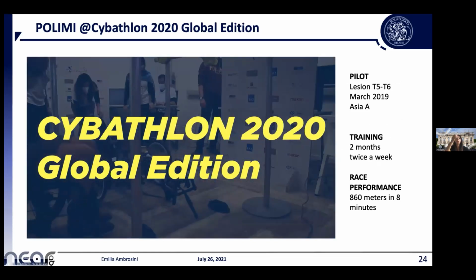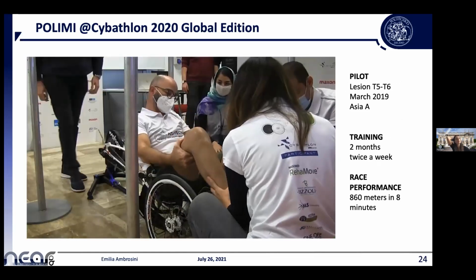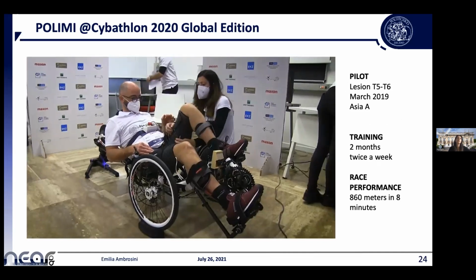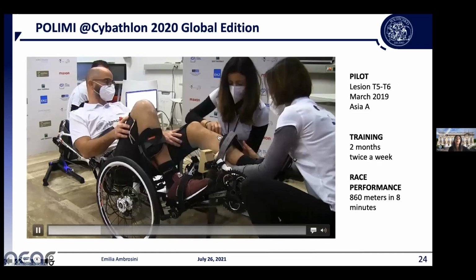As I told you, basically every team competes in its own place. And here you see that our trike was mounted on a smart trainer.